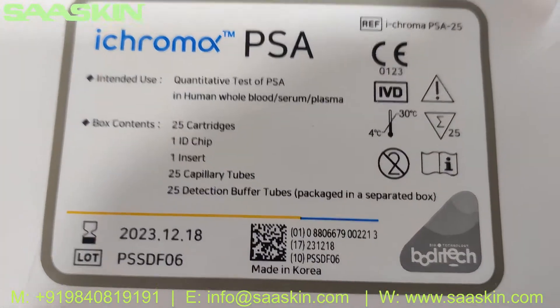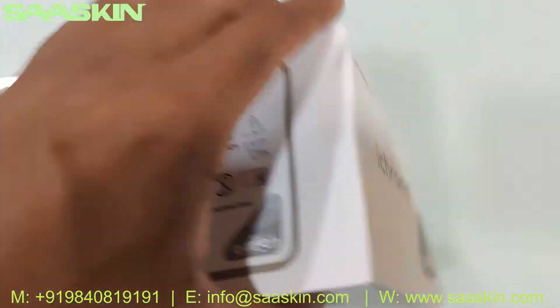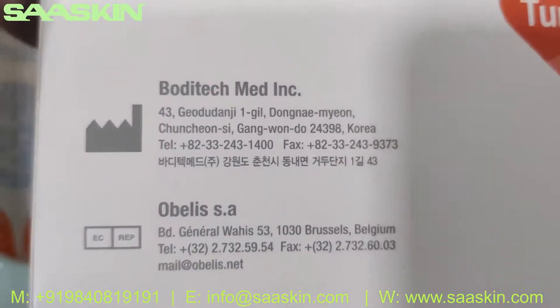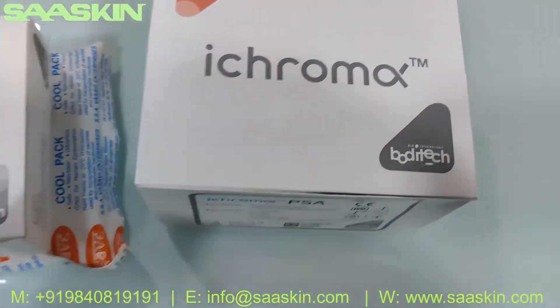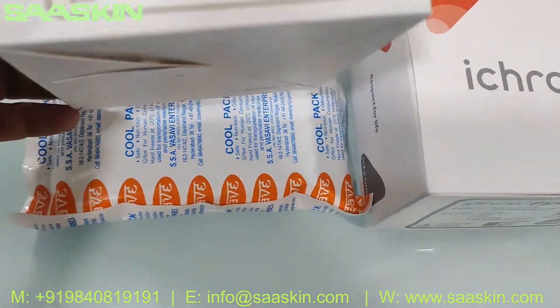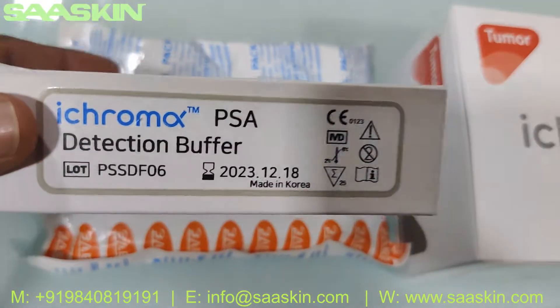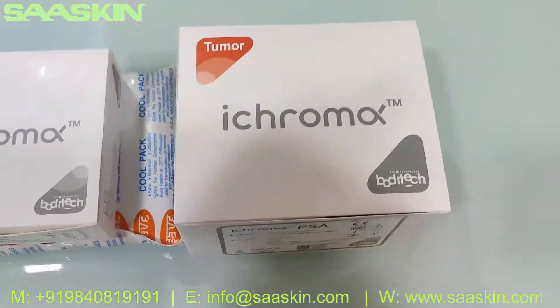25 detection buffer tubes packaged in a separate box. This is the box — let me go over it. You can see it is manufactured in Korea. That is the top of the box, and along with that you get a temperature-controlled box. I've kept it in a cold pack — this is the ichroma PSA detection buffer.